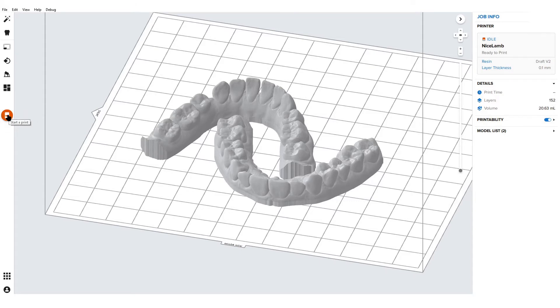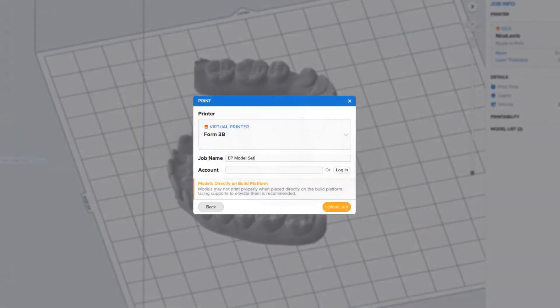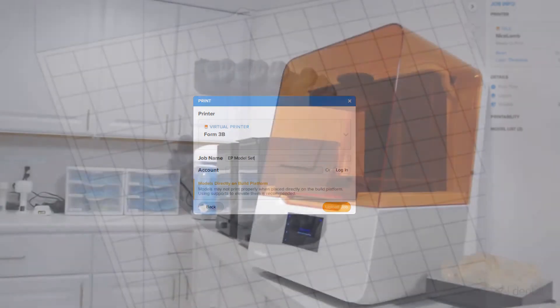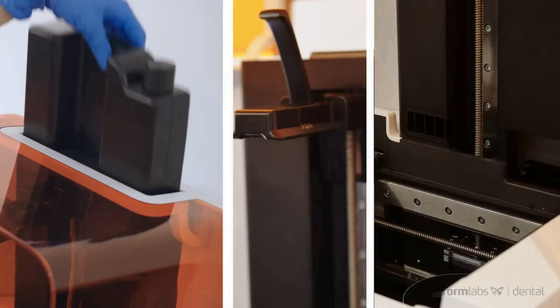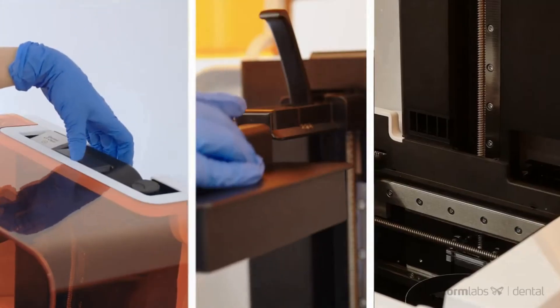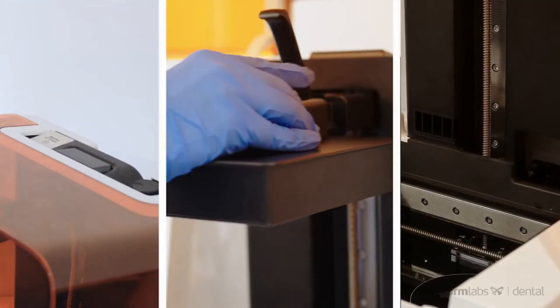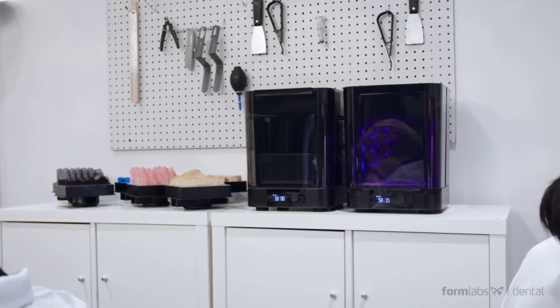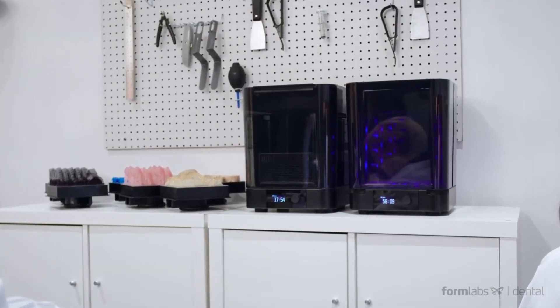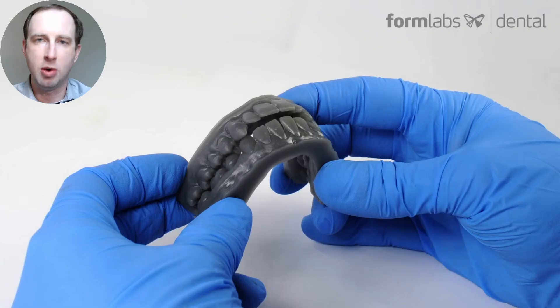From here, you can set up and use your model like normal. Once the job has been set up and the model's been built, you send it to the printer, you put in the resin tank, build platform, and resin cartridge, and print like normal. Then you use our automated post-processing wash and cure system, and you have a model.